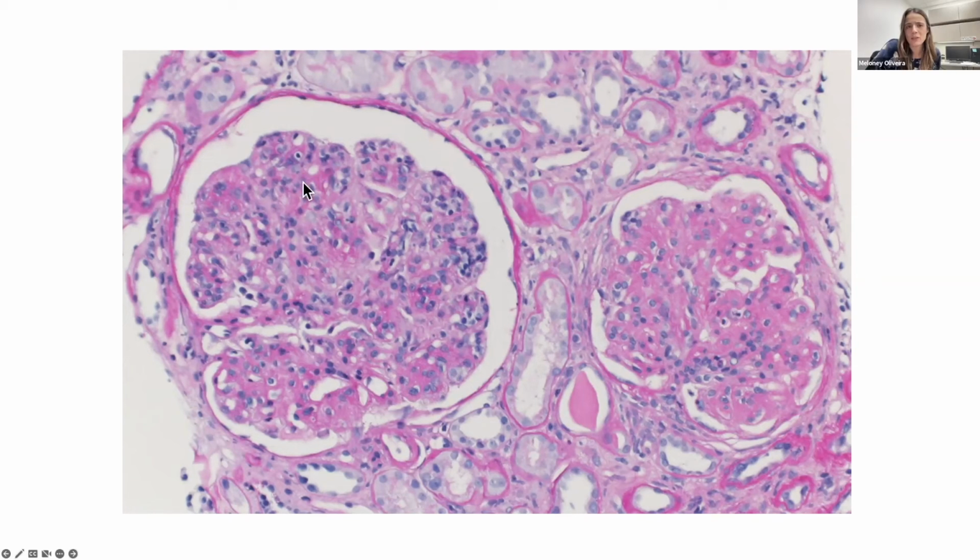What's the giveaway, Dr. Corbett, that it's mesangial interpositioning that you're seeing? Because you see the nuclei all around that open capillary lumen there. Look, I can't point, but all these nuclei that go around it, right above it. When you see the EMs, if you remember the previous EMs where you saw how small the lumen was and how big the capillary wall was, a lot of that capillary wall was interpositioned by cell processes and, in many cases, nuclei.